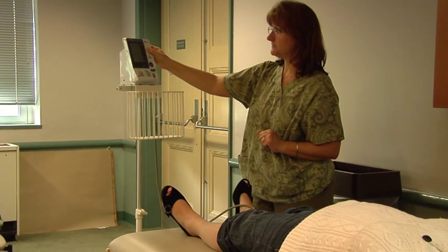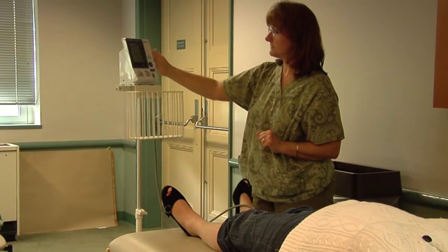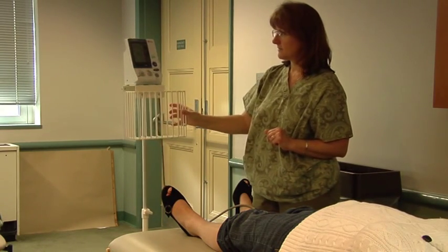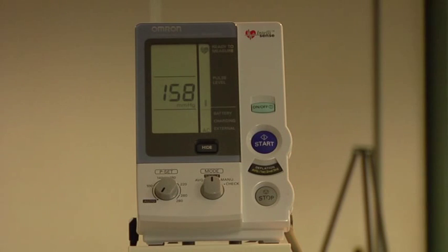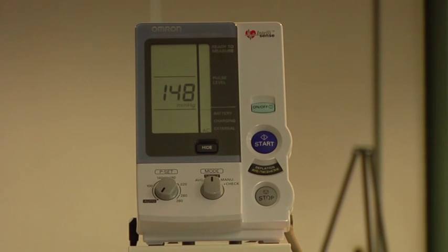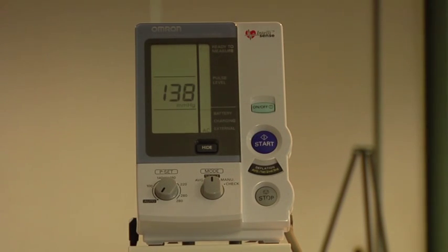Our ABI test takes less than 10 minutes. It is critical to detect PAD early because an abnormal ABI is linked to higher risk of heart disease.